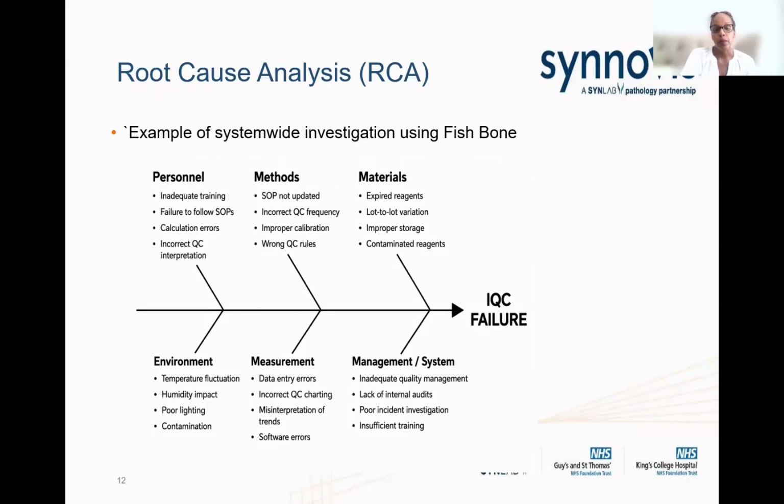That's really important because people often take the QC material out of the fridge, run it, and leave it out, and the stability deteriorates depending on how long you leave it at a temperature where the QC material shouldn't be stored in the first place. So if you're running it, you bring it up from the wrong temperature, you run it on the instrument, and then you put it back into the storage temperature of 4 degrees or whatever the manufacturer suggests.